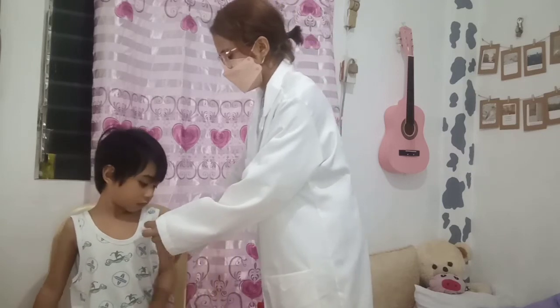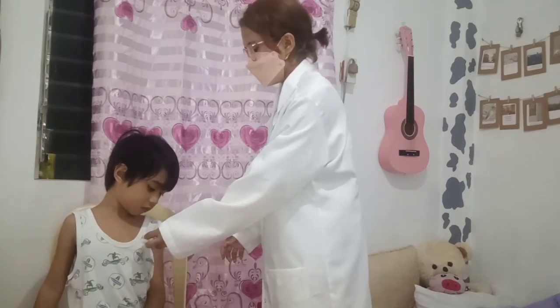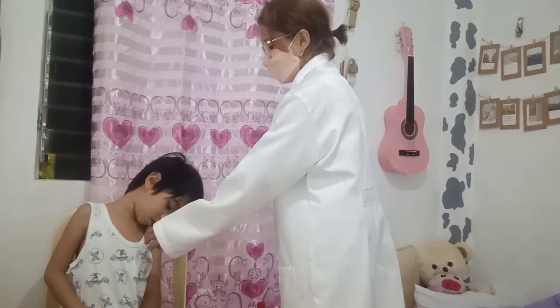Place the probe tip under the arm so that the temperature will be detected. There will be a beeping sound as soon as the thermometer finishes measuring the temperature.